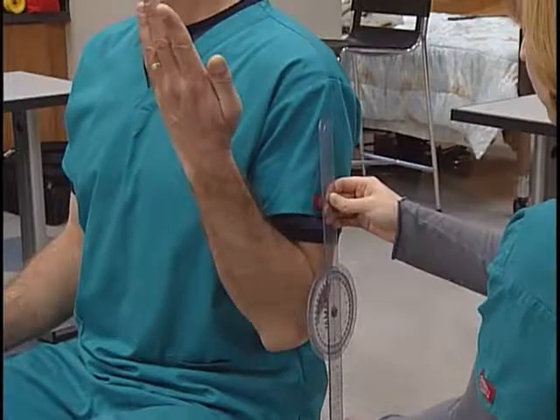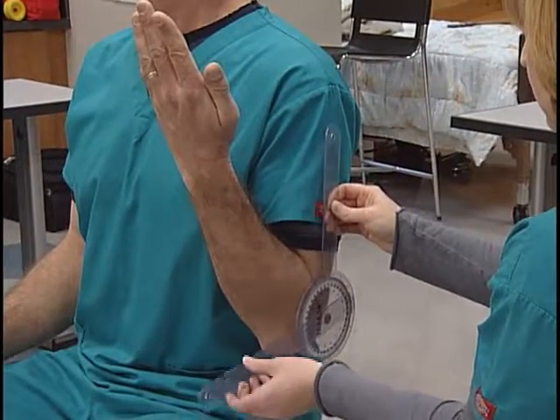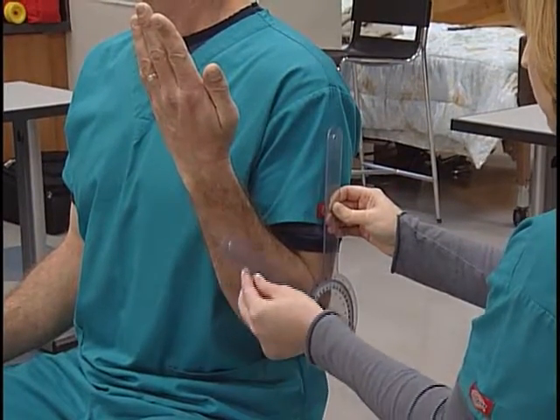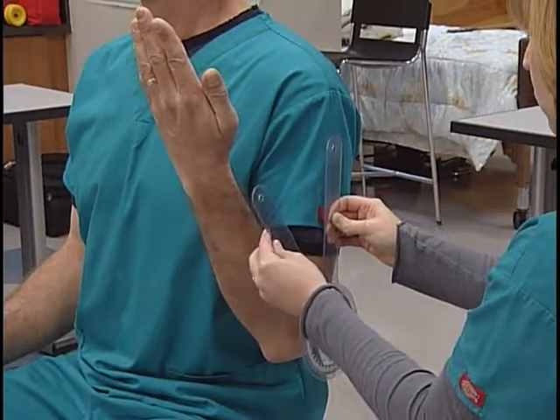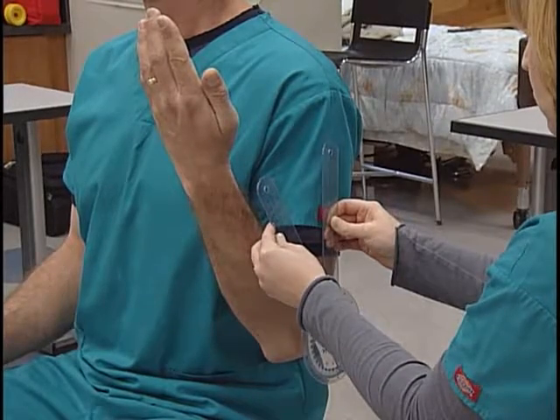The client's forearm begins in an extended position and is raised in a sagittal plane of movement. The measurement begins at zero degrees and can range up to 135 to 150 degrees.